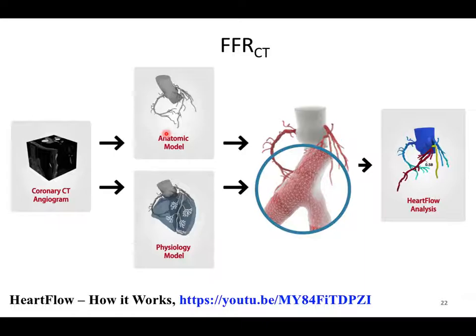we can run a calculation and determine what the pressure is along the vessel, right, given the flow that's going through that vessel. And if we measure the pressure as we move down the vessel, that's essentially like measuring the FFR, the fractional flow reserve, without a catheter in there, right? Just based on the computational fluid dynamics.